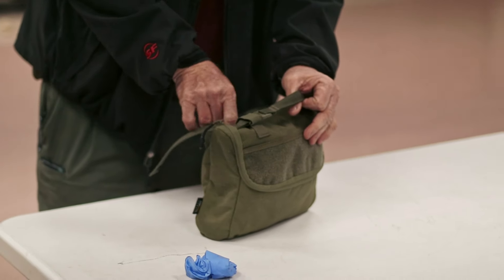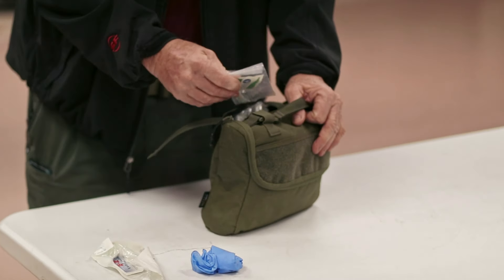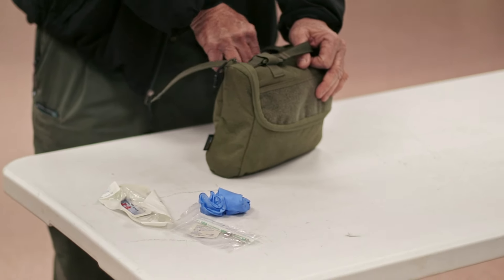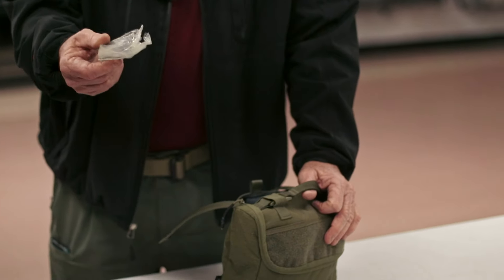I've got a decompression needle for tension pneumothorax, and I've got a roll of duct tape if I had to close a sucking chest wound.